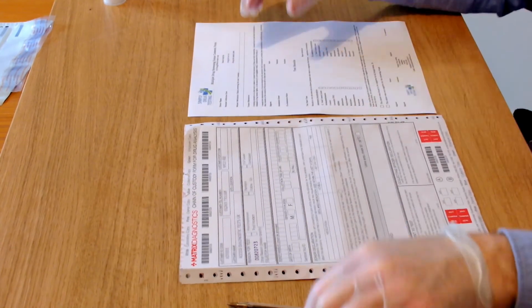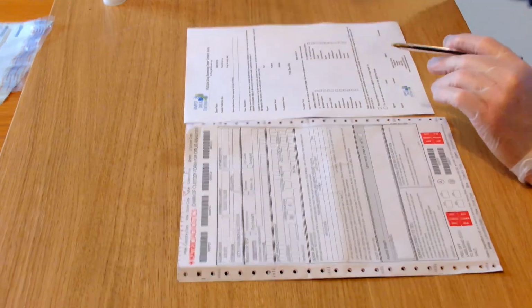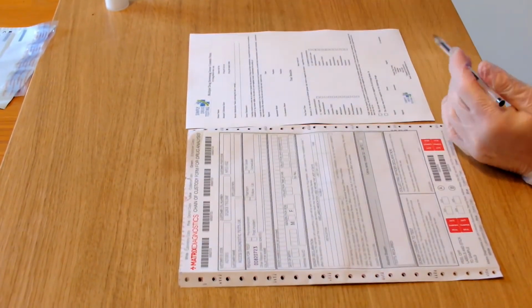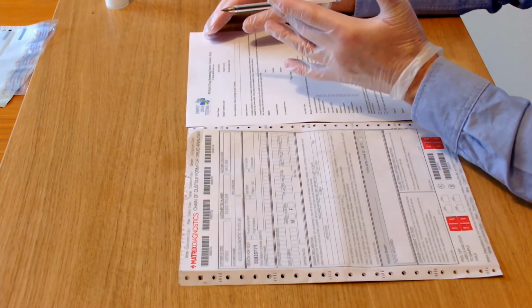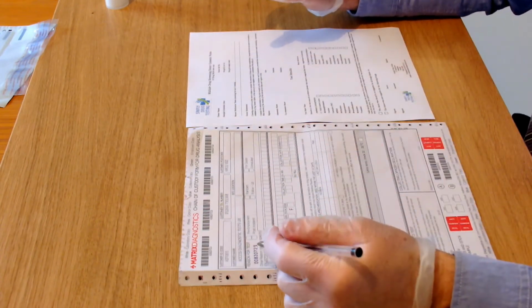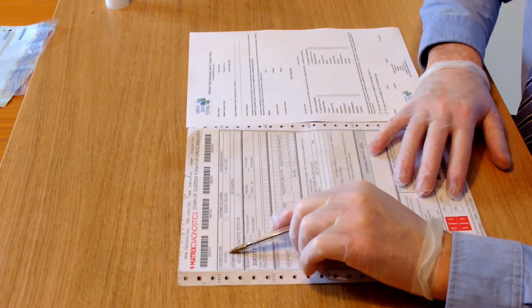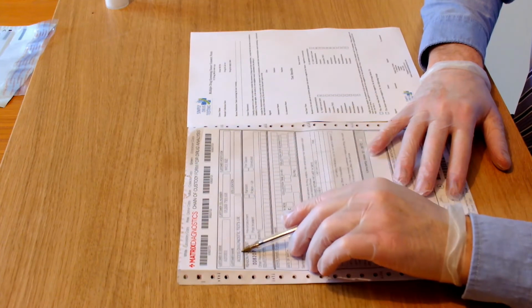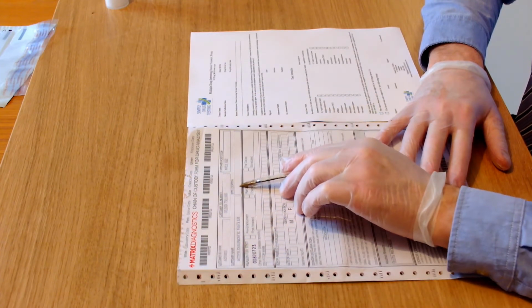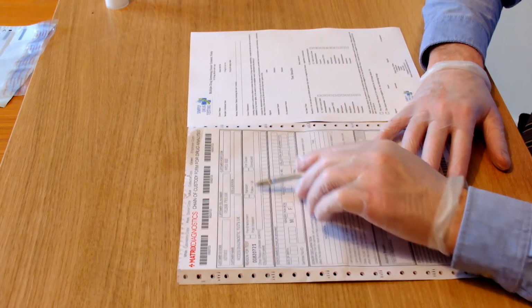So we're going to take our initial donor consent form, the one we filled out when we did the instant test, and we're going to transfer most of the information from that form onto the chain of custody form. So on the form here is customer ID code, customer telephone number, customer postcode, customer name and site location, and the site location would be your company name and where you're located.